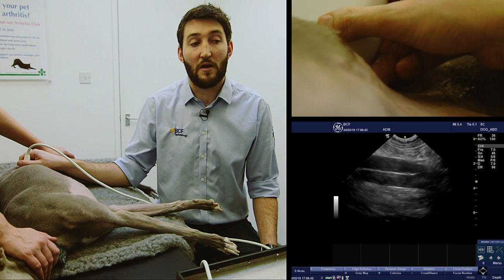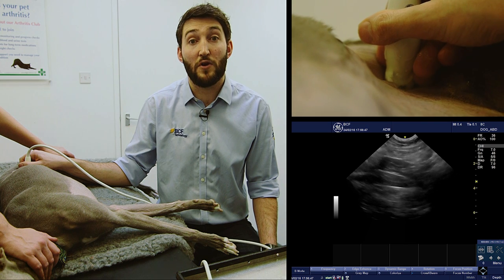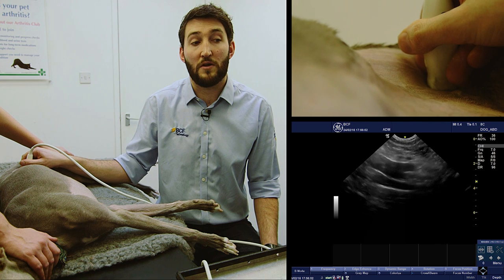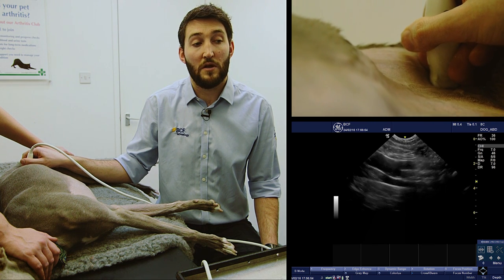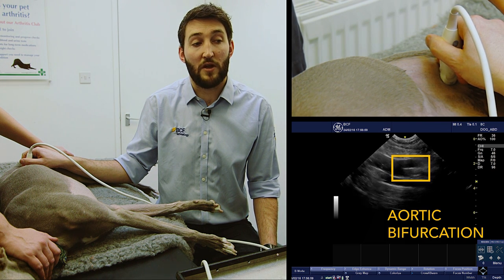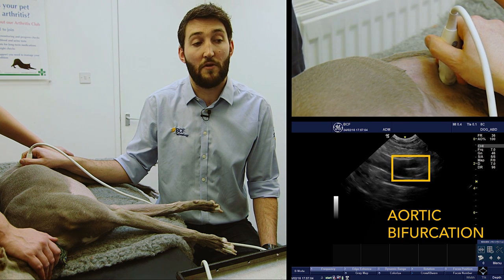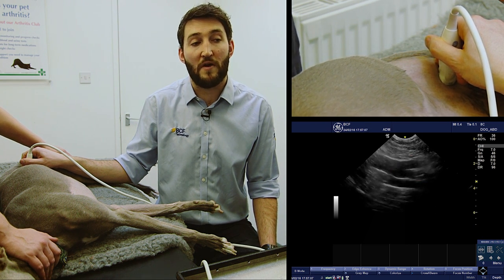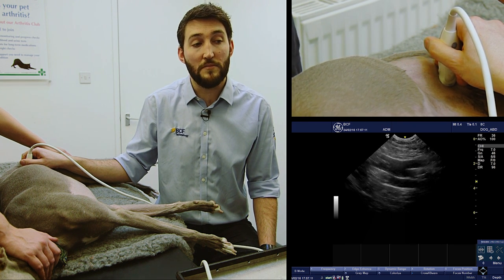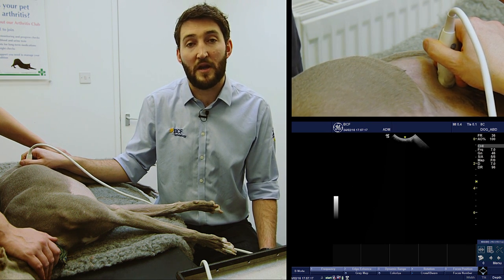As you go, you might wander off course slightly and lose the vessels from the screen. If you do that, stop, make minor fanning adjustments, and then keep going. We're going to slide all the way along until we get on the screen the aortic bifurcation — strictly speaking in fact the trifurcation — and you can see on the top vessel a y-shaped bifurcation where the aorta splits into the two external iliac arteries. We can also use this as a great landmark for finding the medial iliac lymph nodes.